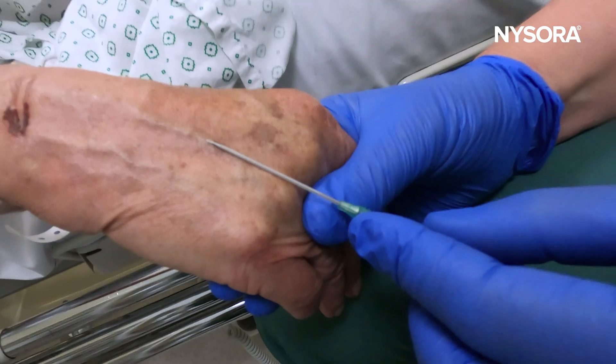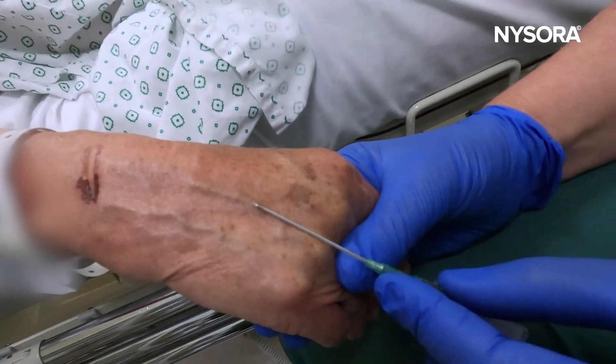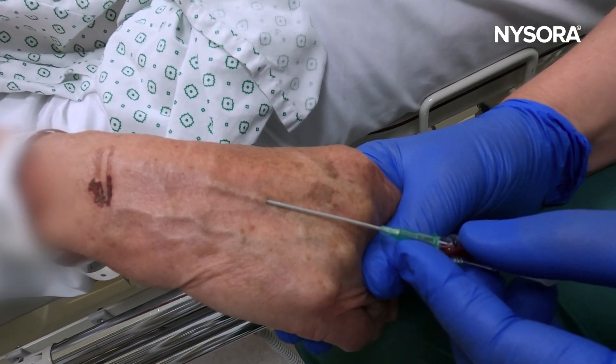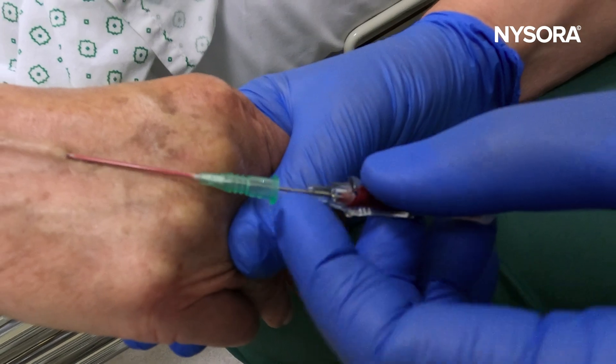You can see how low an angle she assumes when she approaches the vein — super low angle. Because if you assume any larger angle than that, you will not be able to cannulate any of these veins.